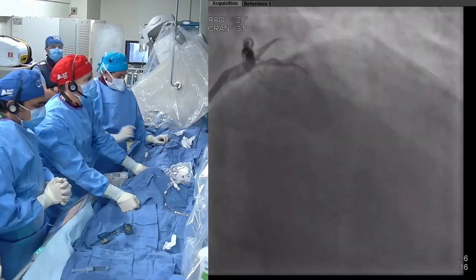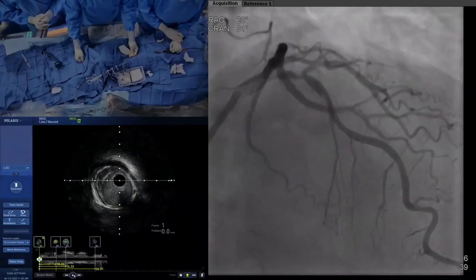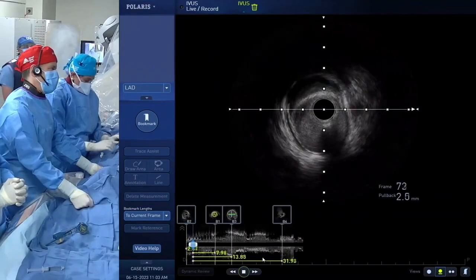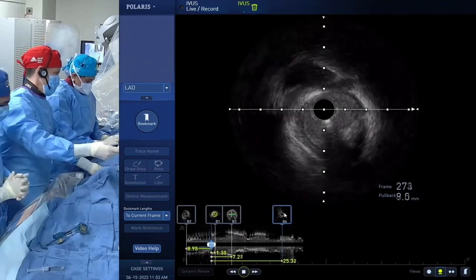We can show the IVUS. Yeah. So you chose IVUS. I second. I know you use a lot of OCT, but let's see what you got. Go ahead. Okay, I will start the pullback. Sure, this is a mid LAD. IVUS, yeah. Here's also eccentric plaque, but I also see the half moon sign. This is a kind of myocardial bridge. Here's also eccentric plaque, some milking.